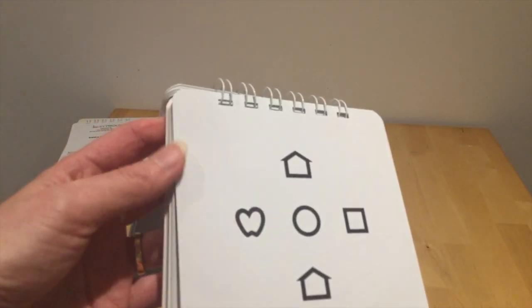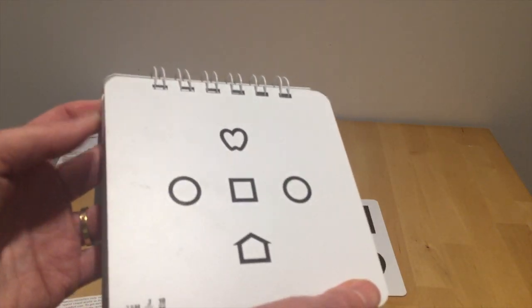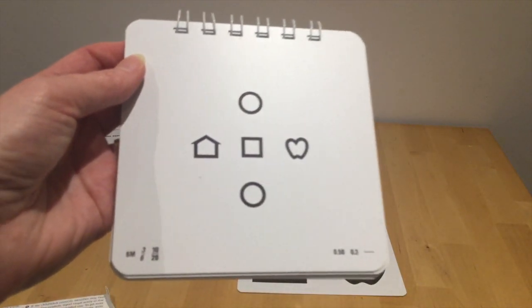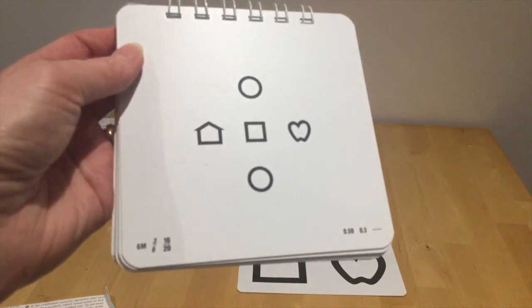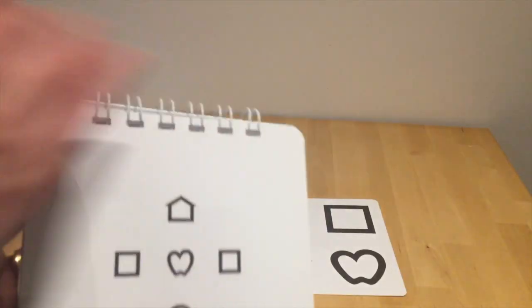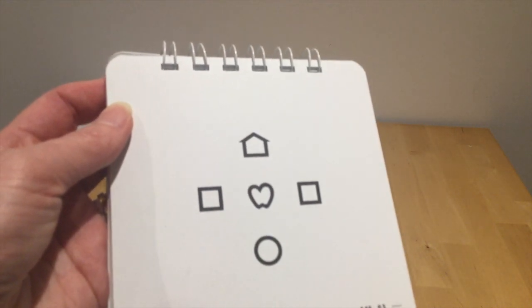So 3 over 7.5, what's the one on the left? It's the heart. So you might want to flip on. Still 7.5. So 3 over 6, what's the symbol on the left? It's the house, and maybe they're struggling a little bit. So maybe you want to ask the next one, and maybe they think that that's a house as well.